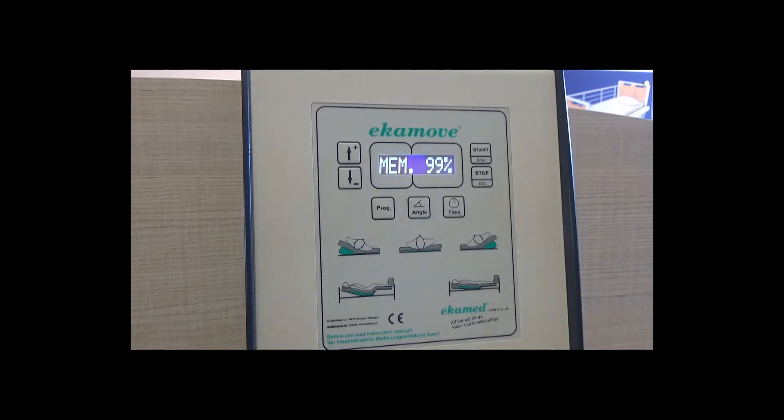You will see the software version number and the percentage of memory capacity left on the memory card rolling across the screen. The word 'empty' then runs across the screen and the system will automatically withdraw all air from the air chambers and calibrate the sensors. Calibration takes approximately five minutes, but it is important to complete the process.